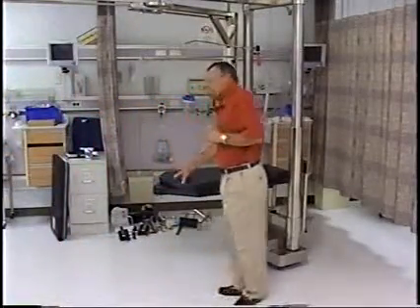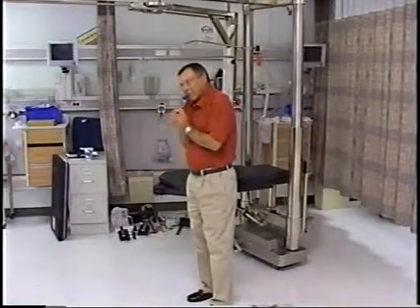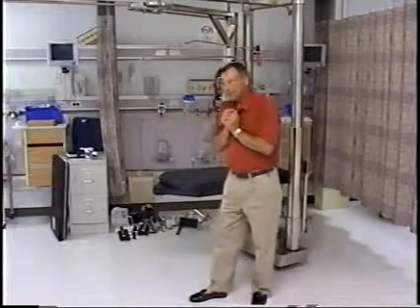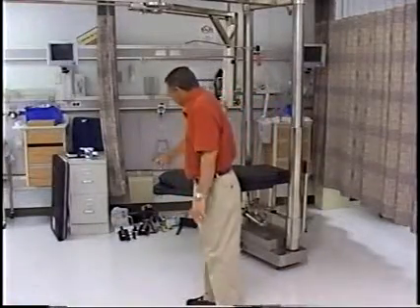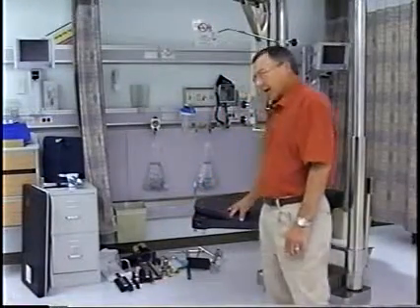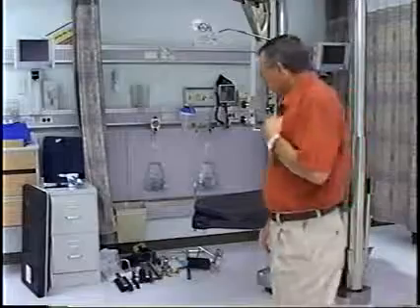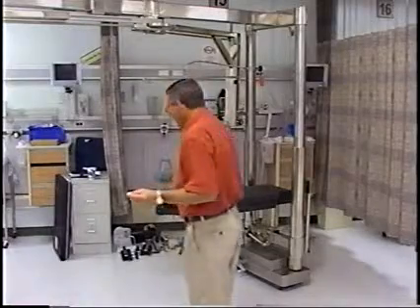The other thing you need is a counter traction device. If you pull on something, it's going to pull right off the table unless you have a means of stopping it. So we're going to put a counter traction device in here. The other thing we're going to have to do is find something to do with the well leg. Okay, the leg that's not affected.